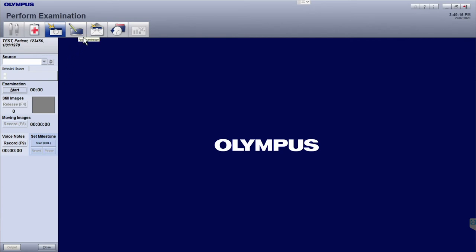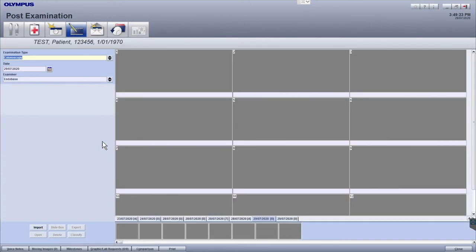Moving across to the next icon with the film strip and the pencil, this is the post examination module, which allows you to select and annotate the procedural images that you want to use for your report. You will also be able to add anatomical graphics to your report in this module.